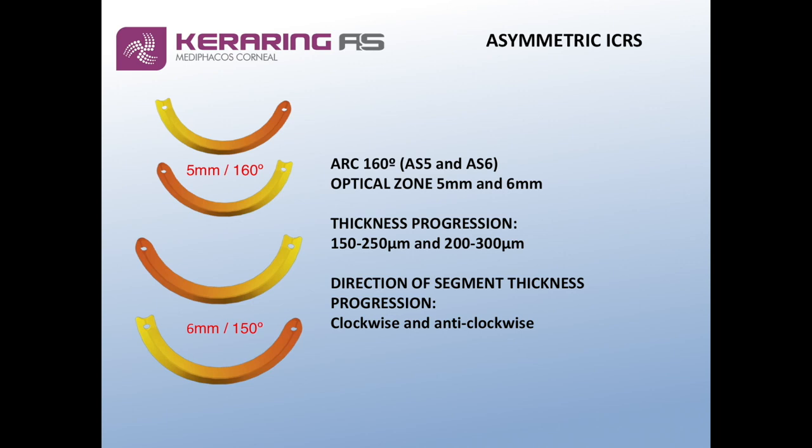However, this does not happen if there is a corneal deformation of an asymmetric type, and later we will see which are the most common characteristics of asymmetric keratoconus.